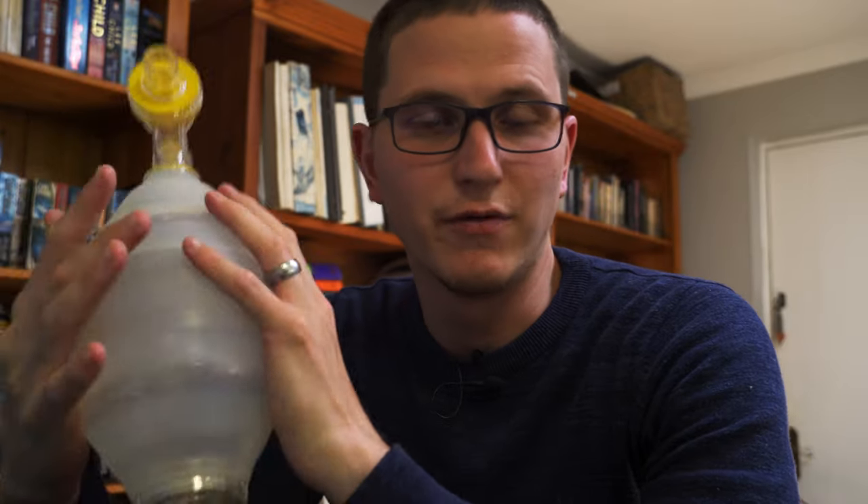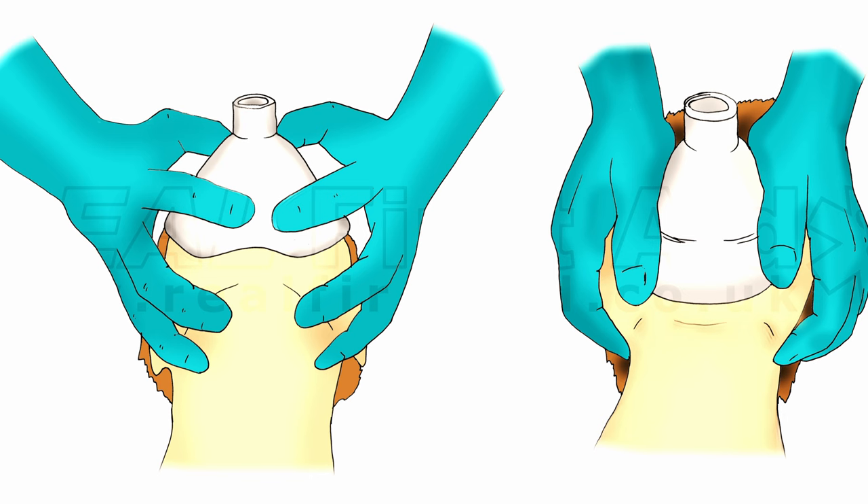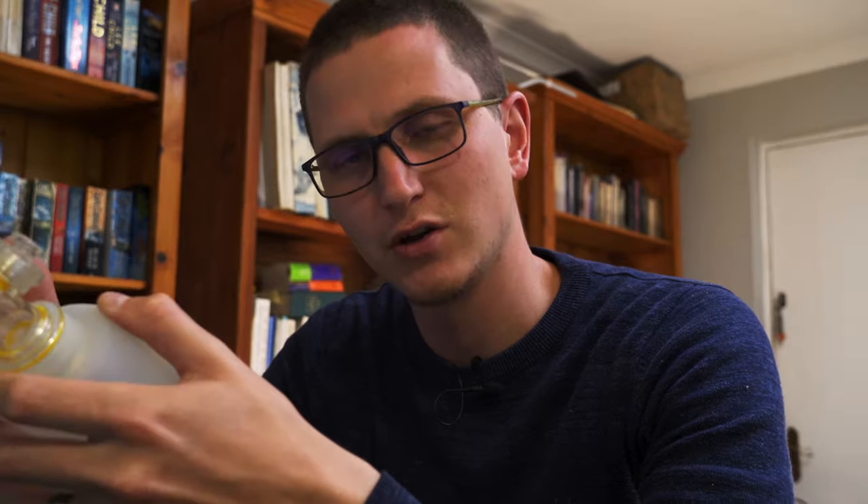If you limit it to two fingers, you can only give so much pressure because your fingers are only so strong. Sometimes we see everyone putting all 10 fingers on the bag — that would be like 100 centimeters of pressure, which I think I could generate. We recommend a two-hand double CE grip, or two thumbs, or a double thenar eminence grip on the patient's face, with a second person ventilating. That way we can hold a proper mask seal and are far less likely to over-ventilate or give too much pressure or volume.